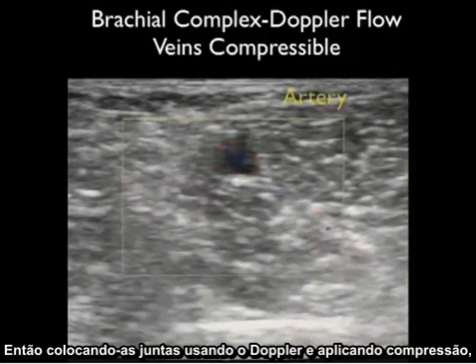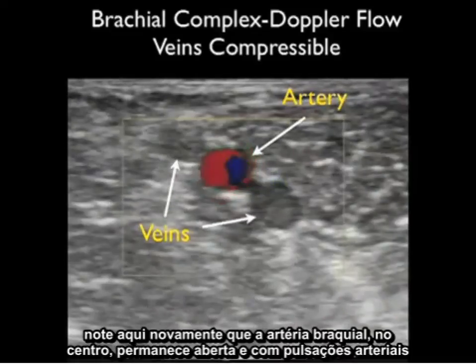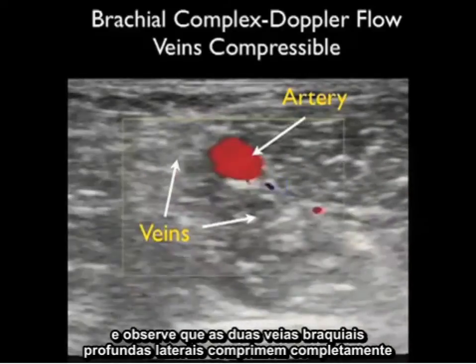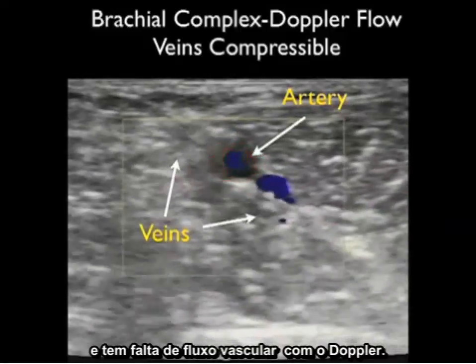Putting it all together — using Doppler flow and applying compression — notice that the brachial artery in the center stays open and has brisk arterial pulsations, while the two flanking deep brachial veins compress completely and show a lack of vascular flow with Doppler interrogation.